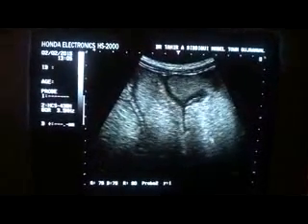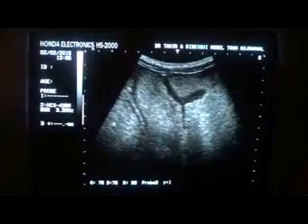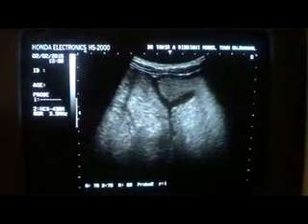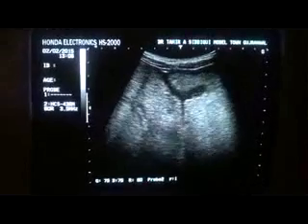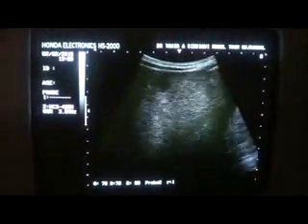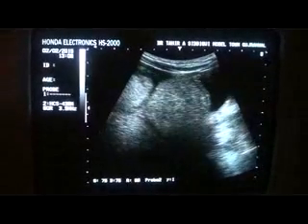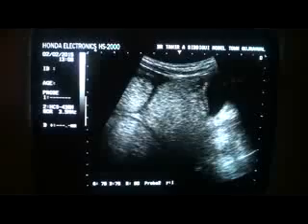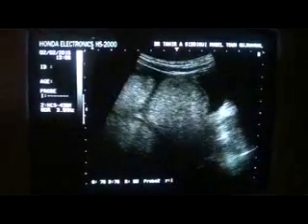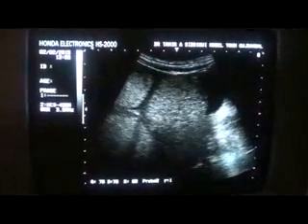See the movement among these 1, 2, 3, and 4 segments of bowel that are in front of you. These are distended, and here this is the urinary bladder. You can see fluid between these distended bowel loops, which is called interloop fluid.